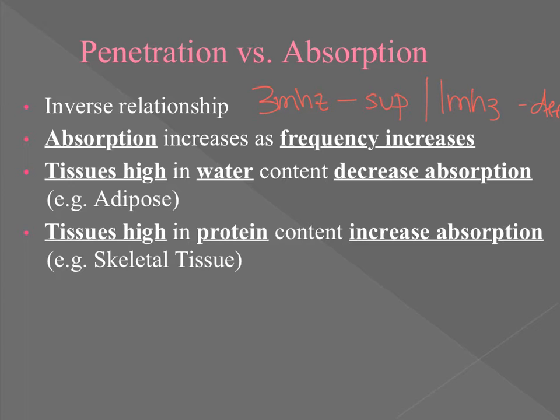Now, let's think about this a little bit differently, right? I want to give you some numbers, but then we'll talk about it again. But a 1 megahertz treatment, that deep treatment, is capable of penetrating about 5 centimeters. And then a 3 megahertz treatment is typically capable of penetrating about 3 centimeters in terms of its depth. I hope that makes sense to you all. If not, email me and we can discuss it.